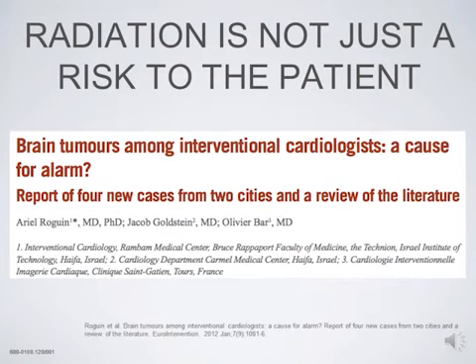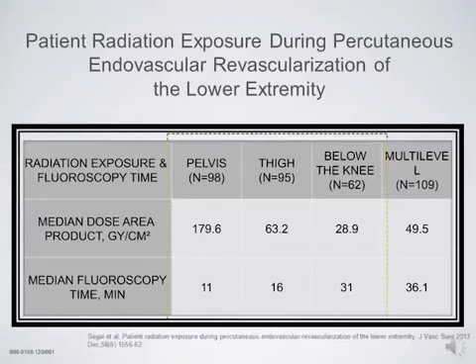So why is radiation a problem? Well, there are multiple health risks to not only the physician and the patient, but others in the room. There have been multiple reports on things such as brain tumors and left-sided brain tumors, which is the side where the radiation exposure is the greatest for all interventionalists.